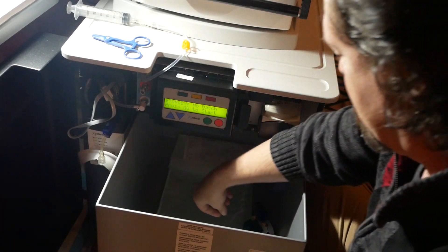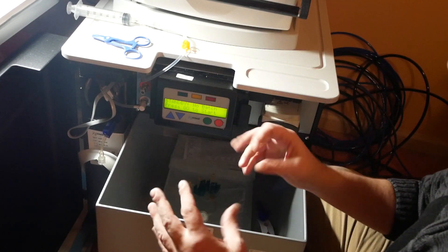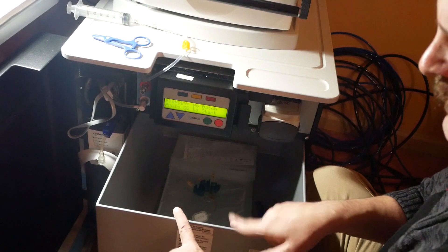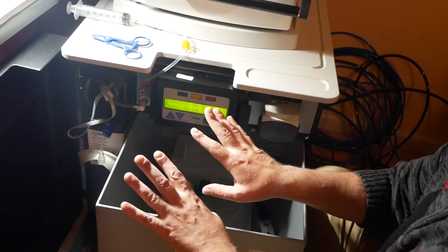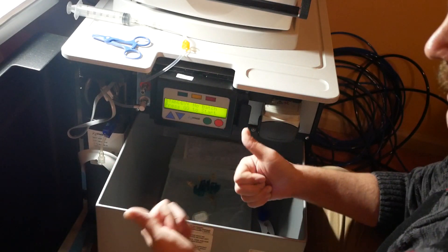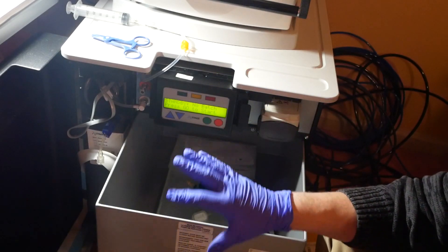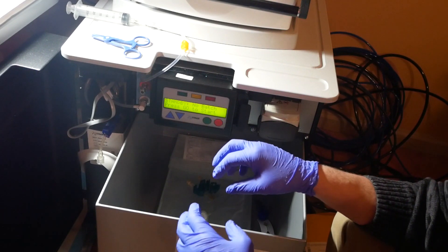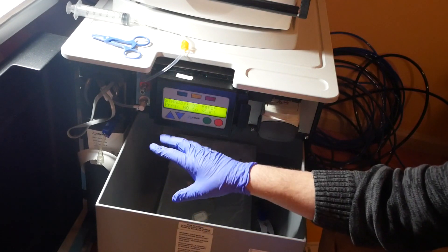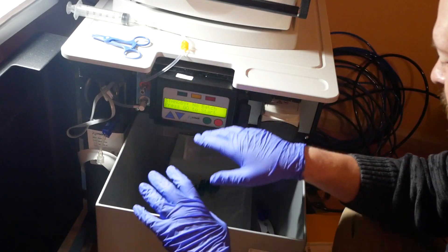Before you start touching the line on the new sack, before you start hooking things up, go ahead and put gloves on. I've got my gloves on now. I'm going to reposition the camera so you can see what I'm doing down in here and what's happening on these connections, because that's really what you should be paying attention to.